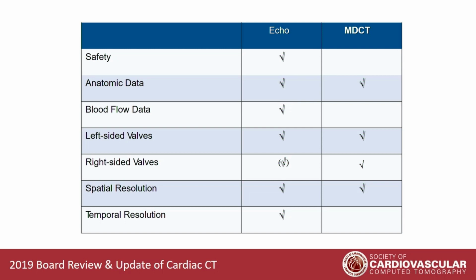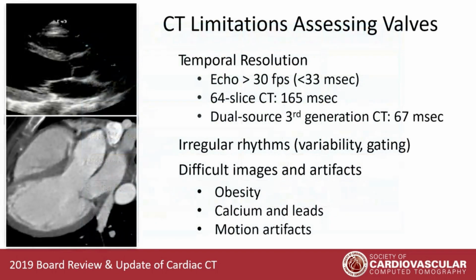Left-sided cardiac valves, again, same comparison we've already talked about. Right-sided cardiac valves, if you do echo, you know that sonographic windows can be a bit of an issue on the right side of the heart. CT, honestly, depending on how you do your contrast administration, doesn't care which side of the heart you're on, right? It does not particularly make a difference. Right-sided cardiac chambers, left-sided cardiac chambers, they're all visible using CT. Spatial resolution, both of these techniques are pretty good. Temporal resolution, echo is the winner by a pretty substantial margin.